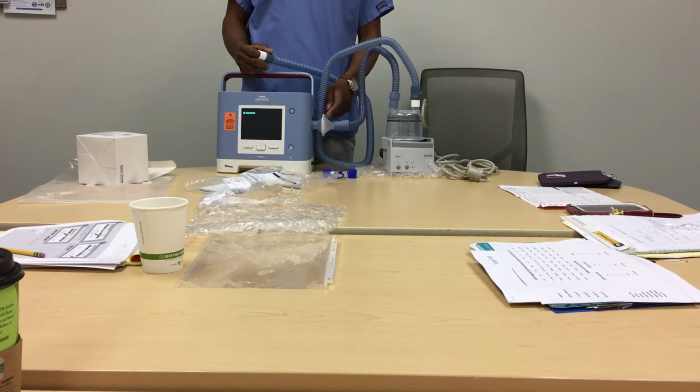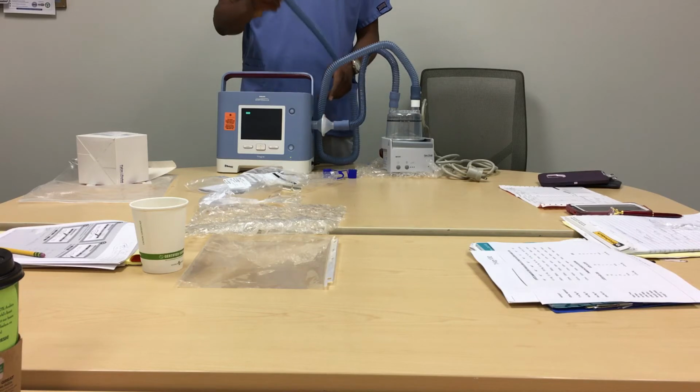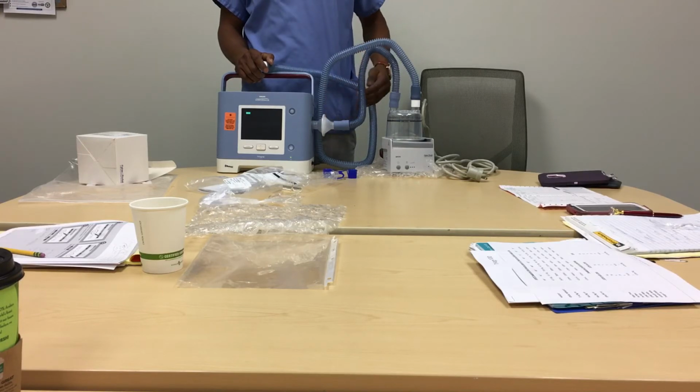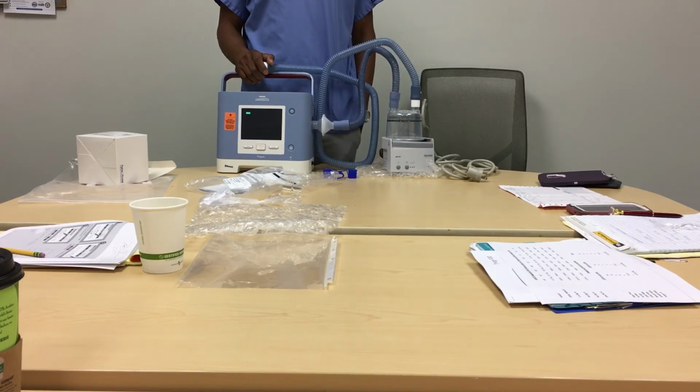Remember about your bacterial filter, right? We got a case where the husband did not change it for 2 months. The lady ended up in the hospital, in the ICU, with an infection or mold.